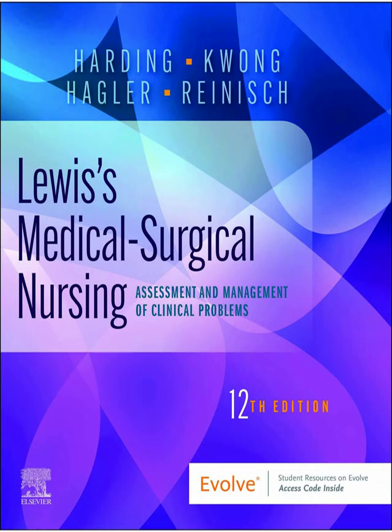Good points. What about pacemakers? Pacemakers. These are electronic devices used when the heart's own conduction system is damaged and can't pace properly or fast enough. Like in symptomatic bradycardia or high-degree AV blocks. Most pacemakers implanted today are demand pacemakers, meaning they sense the patient's own heart rhythm. If the heart beats on its own at an adequate rate, the pacemaker just listens. But if the heart rate drops below a certain preset level, the pacemaker kicks in and delivers an electrical impulse to make the heart beat. It only paces on demand.